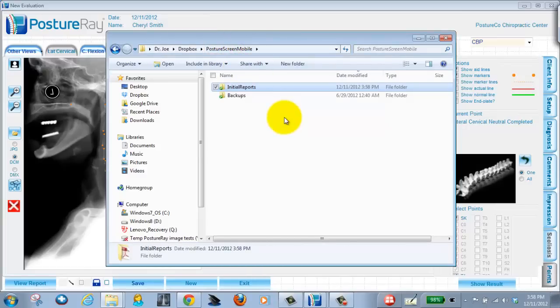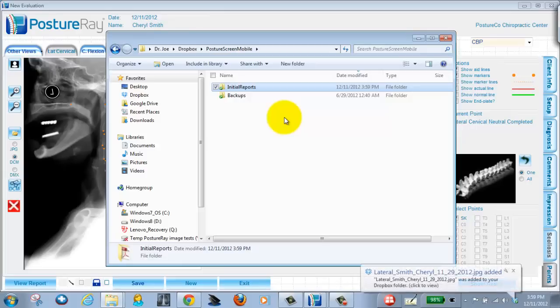So if I go back to the iPad, if you look under digitized images, there's also a choice to upload images to Dropbox. So watch this, I'm going to go ahead and click that button on my iPad. In real time it's going to push the digitized images to Dropbox.